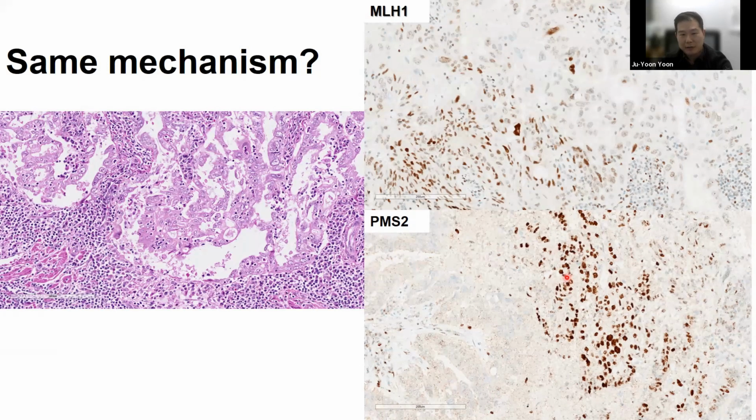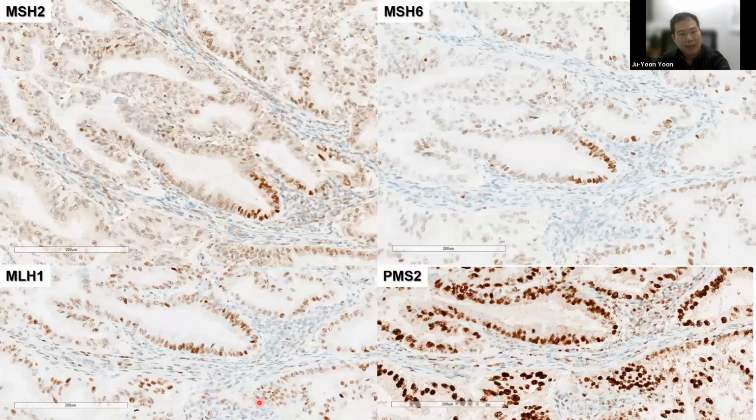Sometimes though, you have to be careful in some of the hysterectomy specimens in the sense they often aren't fixed very well. So you may see almost luminal necrosis in some of the sections, and they stain not well, not unsurprisingly, and had this carcinoma that I'll talk a little bit more about later. But interesting MSH2 and MSH6 patterns. There's one gland here where you see stronger expression at the base of the gland, and then it sort of peters out, some of the areas not seen with MLH1 and PMS2.